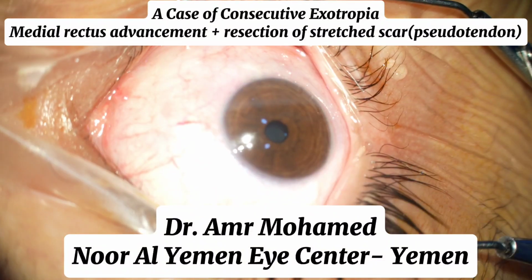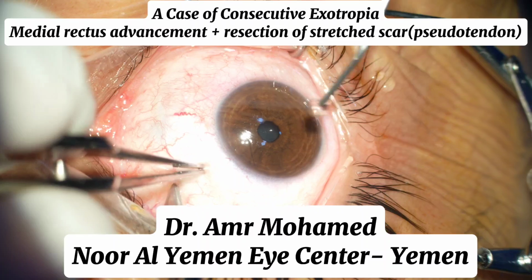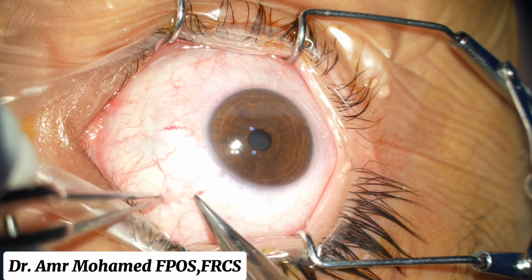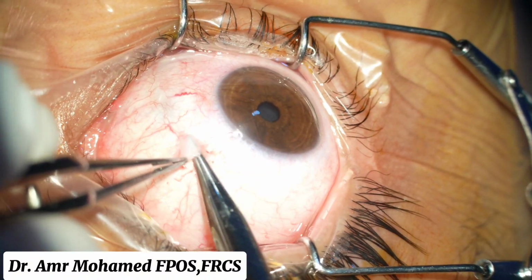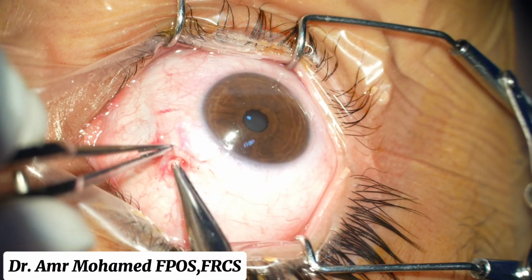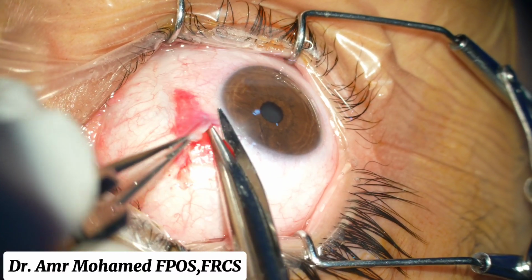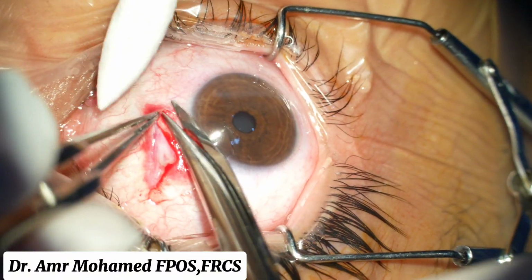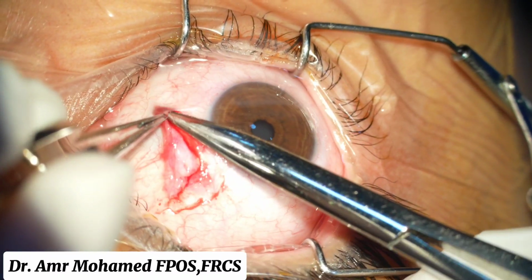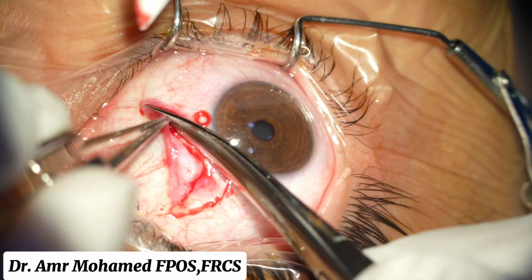Today's case is a case of consecutive exotropia, and I did medial rectus advancement plus resection of the stretched scar or the pseudotendon. You will realize that there are conjunctival adhesions and it's not easy to do the conjunctival opening. So in such cases you need to do limbal incision, and you need to do a large limbal incision. Try to avoid the places where there are a lot of adhesions.